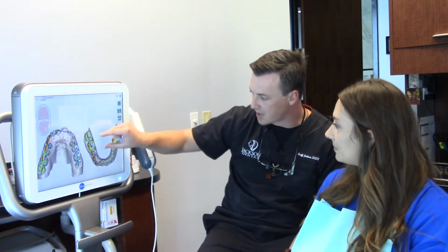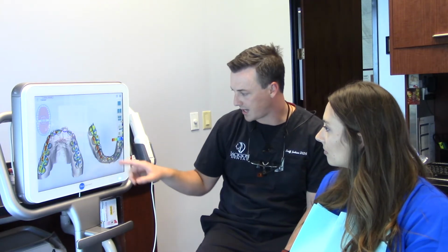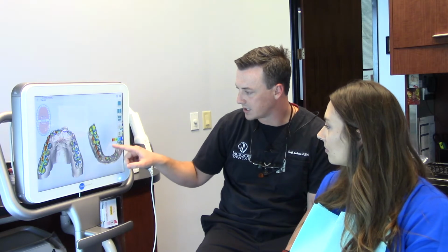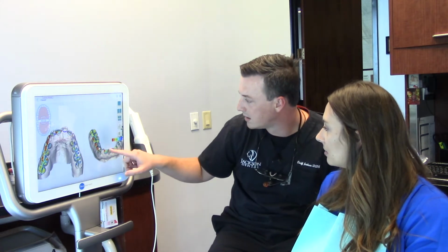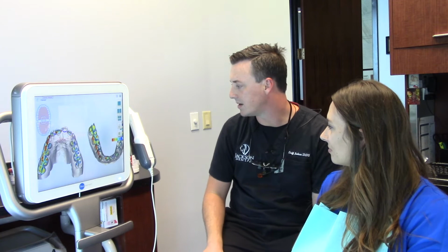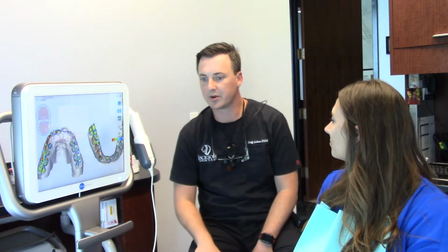Have you ever noticed these little notches on the backs of your teeth, on the molars? You've got a couple potholes there, and a lot of wear right here at the incisal edge. Have you ever noticed that before? A little bit on the front, but I haven't noticed the potholes in the back. Okay. Part of my job is for us to look 10, 15, 20 years down the line and make sure not only that you have teeth, but that you have healthy teeth.